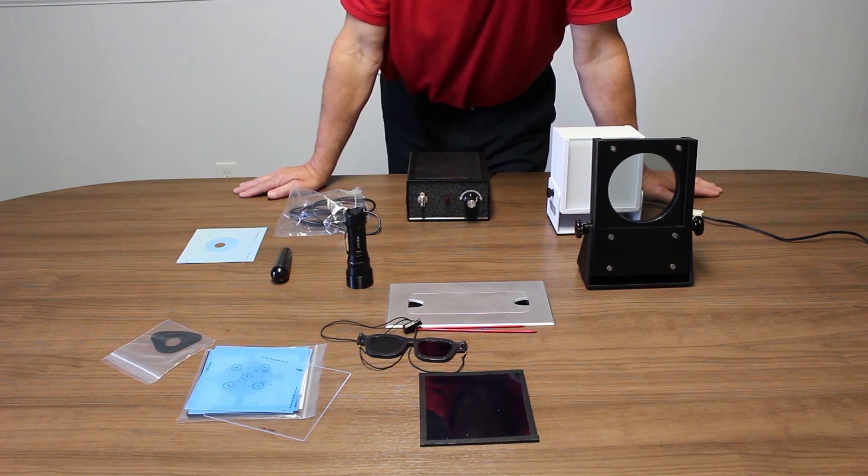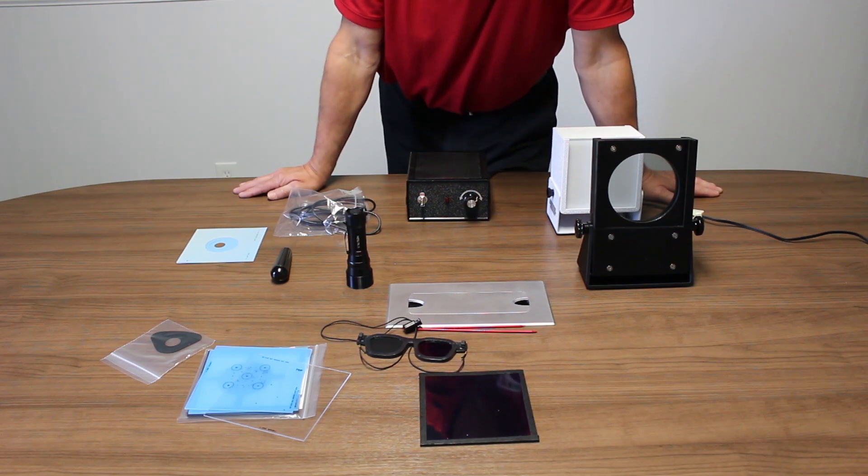The fovea is the center of the vision. We're trying to teach the patient to use it, often in amblyopia or lazy eye. We'll get something called eccentric fixation. This device is used to both test for and train eccentric fixation.